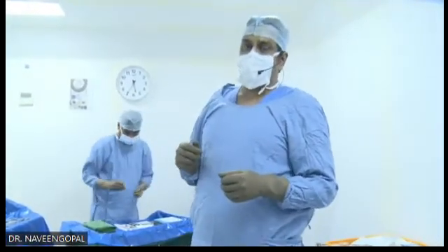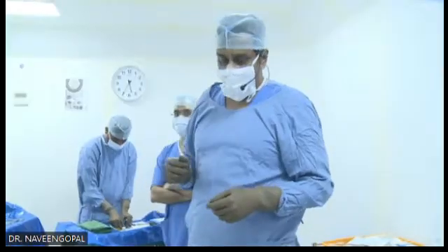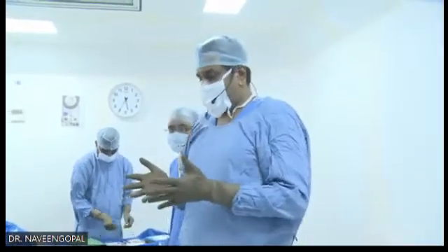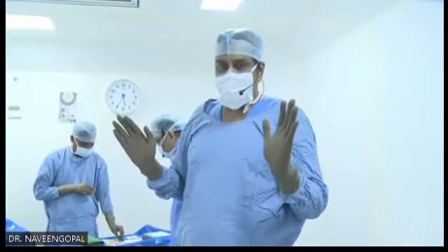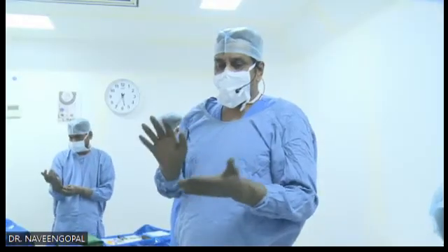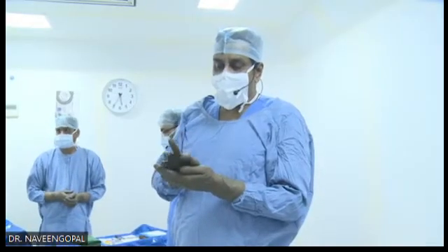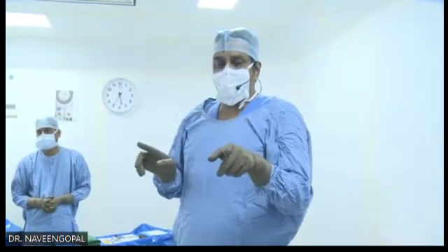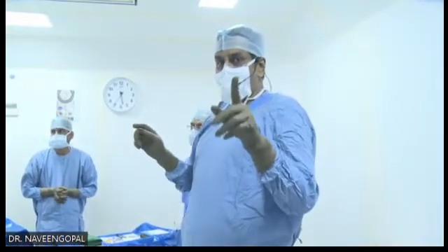Last week, Dr. Chinnappa, I heard, gave a beautiful theoretical lecture to you. I wanted to complete it by giving you practical advice on how to put the ICL. As he told, before opening any ICL, please know where the leading hole is. The leading hole is, as soon as the ICL opens, on which hand the hole is, left hand or right hand. That is important. First thing is over.